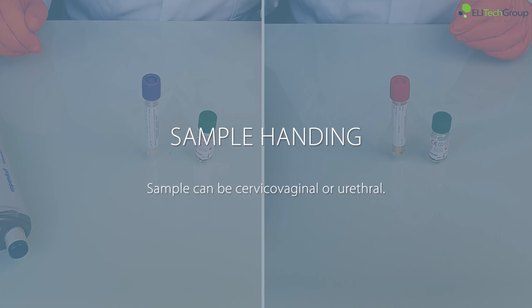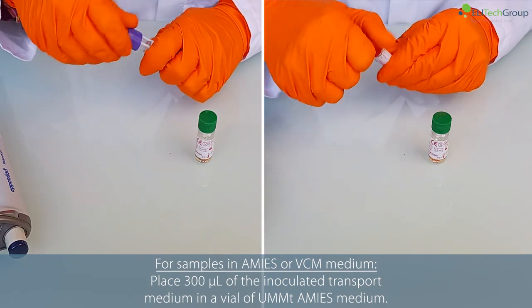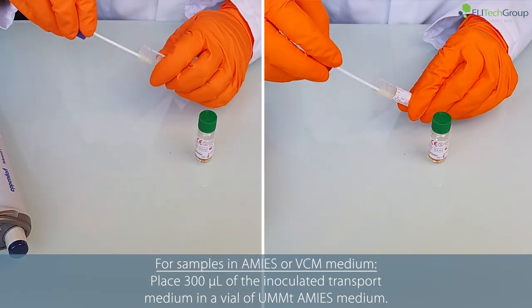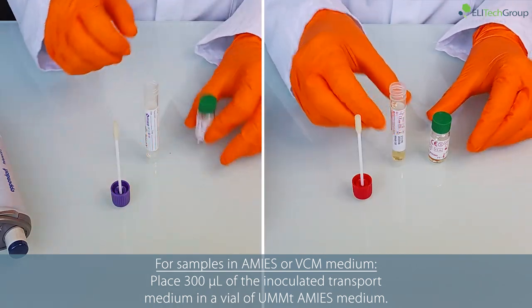Samples can be cervicovaginal or urethral. For samples in Amis or VCM medium, place 300 microlitres of the inoculated transport medium in a vial of UMMT Amis medium.